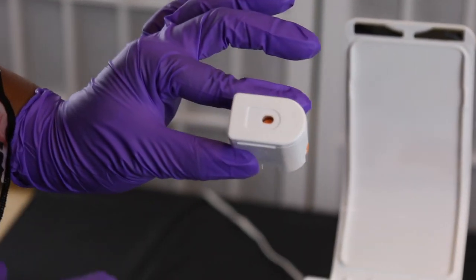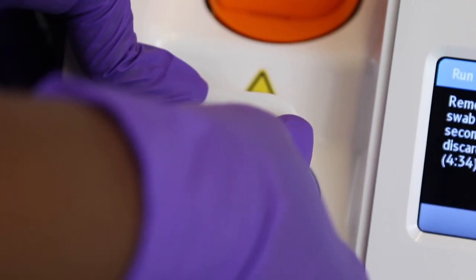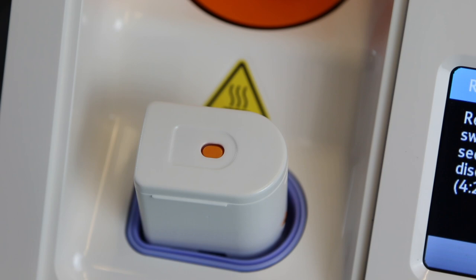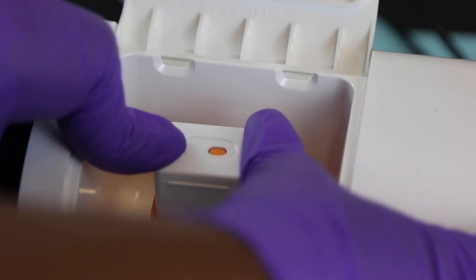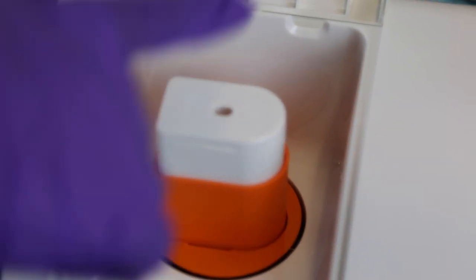Take your white cartridge from package two and make sure it's oriented correctly. Push it into the blue receiver. When you do this, you must verify two things: you must hear a click and you must see the orange button pop up. If this does not occur, your test will be invalid. Then take the white cartridge out of the receiver and place it into the orange base as shown. You must hear a click and see the orange button go down — if this is not done, your test will be invalid.